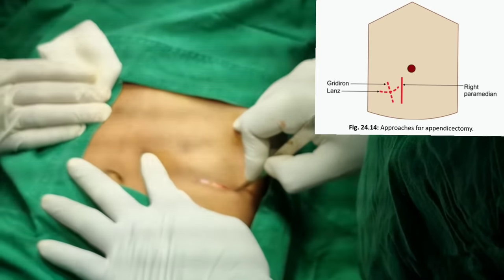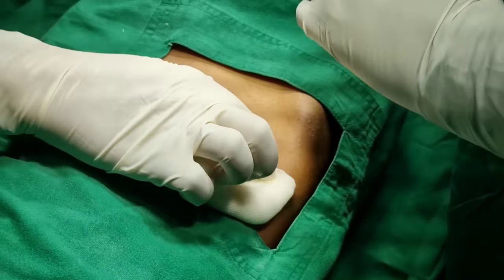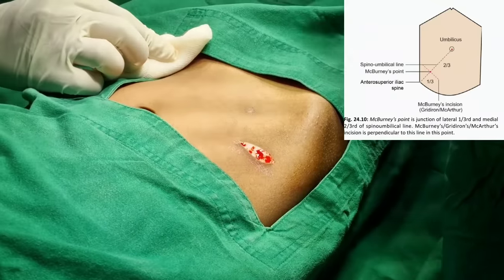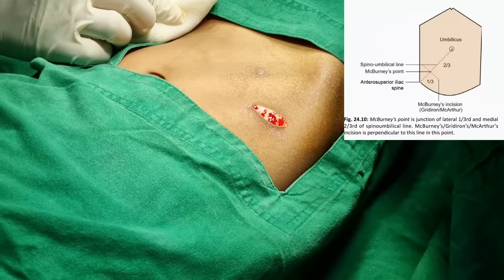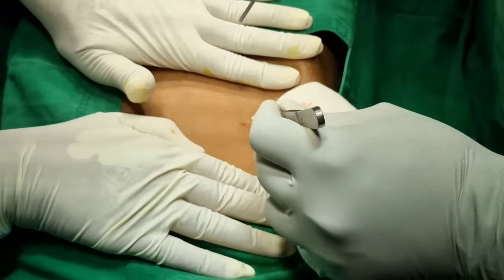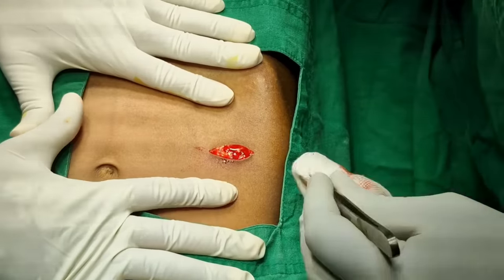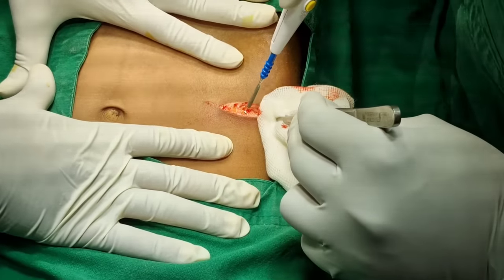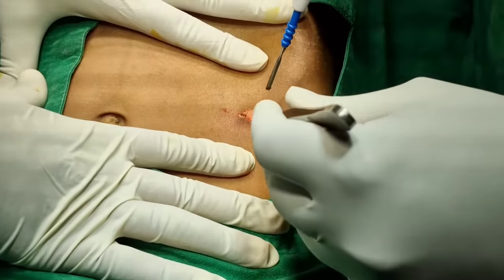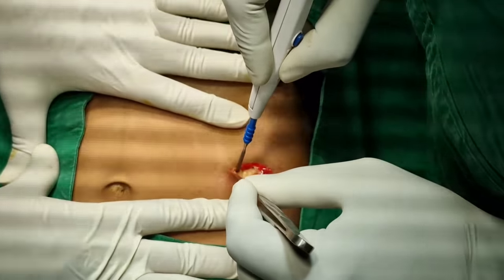In this case, we have taken Lanz incision. It is a transverse incision and modification of gridiron incision. Other incisions are gridiron incision, also called McBurney's incision or oblique incision. Right paramedian incision can be taken for special cases, and also Rutherford Morrison's incision. Lanz crease incision is cosmetically better and exposure is adequate.